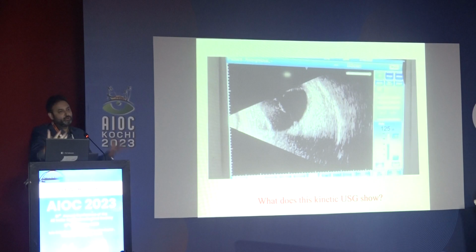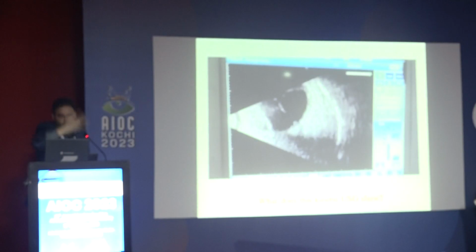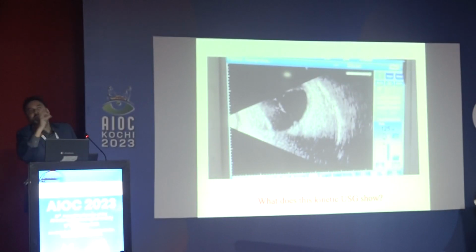However, because this is a non-vitrectomized eye, because they are kissing choroidals, all of the vitreous and everything has been bunched together like that. So that stalk that you see after the choroidals have gone back, all of the muck, the vitreous, the debris, is appearing like that. When you examine this patient clinically with the IO, the media looks very poor. If you look at the side, it looks very nice, because then you're able to see past that central collected debris and through that echo-clear zone. So that was the idea, to show the kinetic ultrasound, what you can look at, and hopefully see.